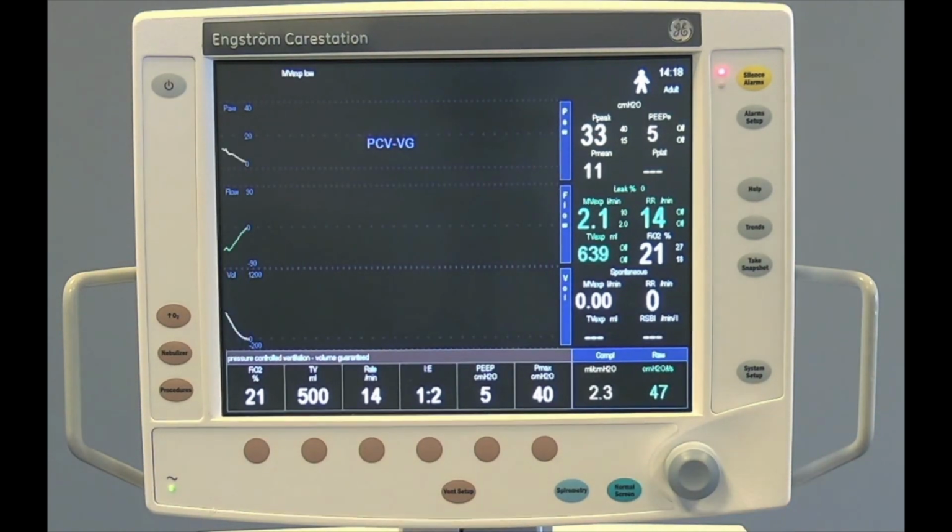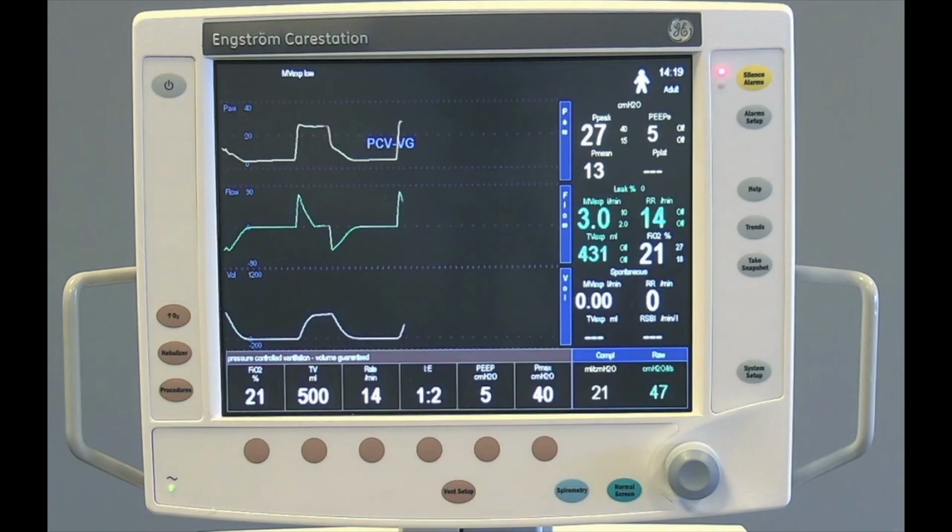After the condition has been cleared, the resolved alarm still continues to display on the alarm message. It appears as a white message on a black background. This can be cleared by pressing the Silence Alarms key.